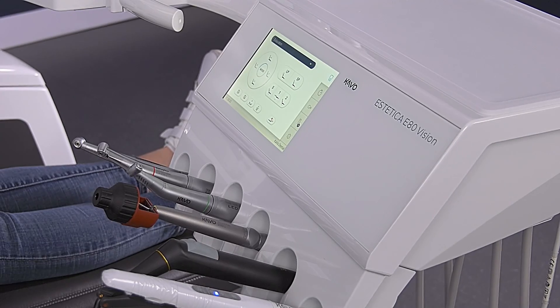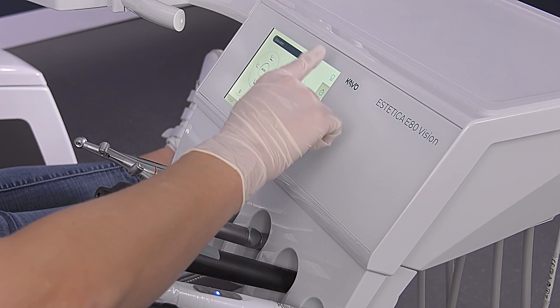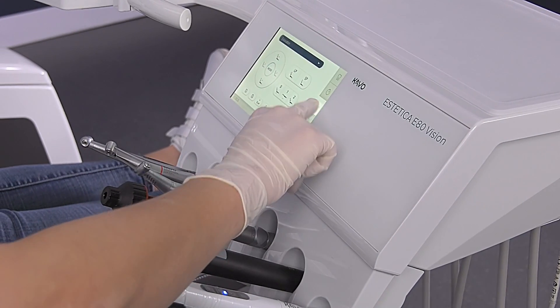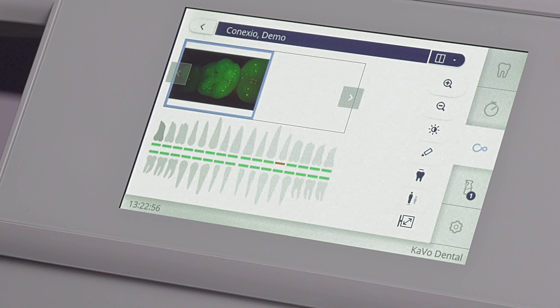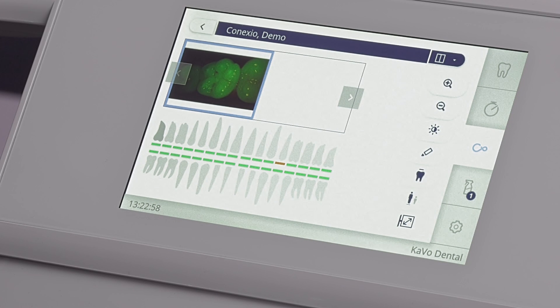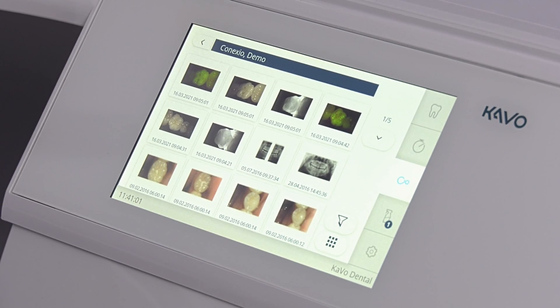If the patient is selected, he or she can automatically be pulled up on your treatment unit's dentist element in the Connexio tab. All subsequent data is then automatically assigned to the active patient.